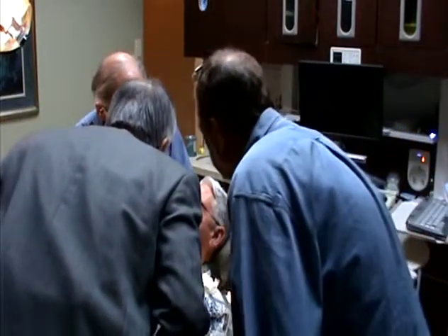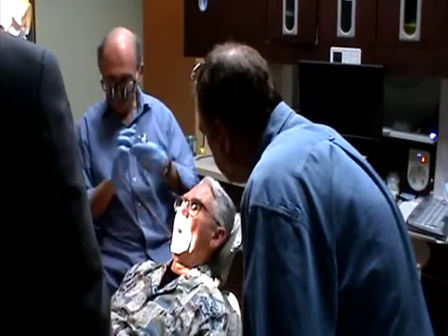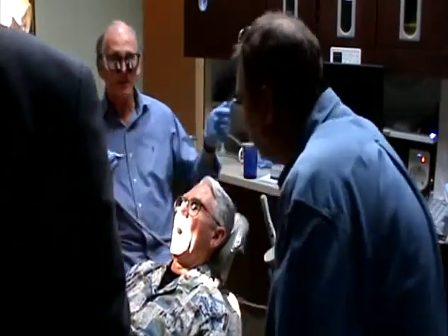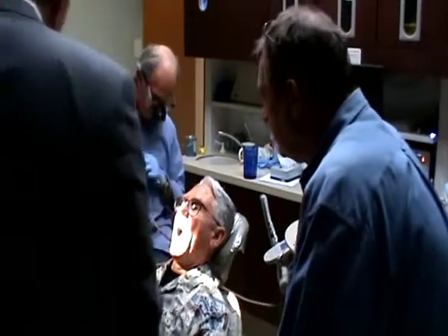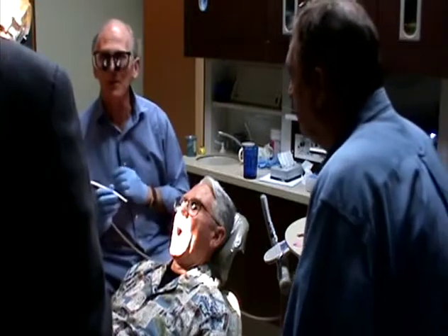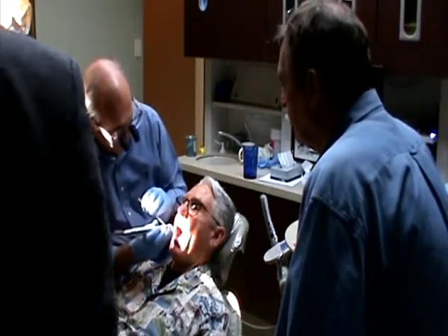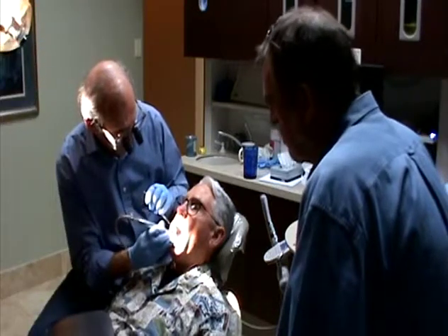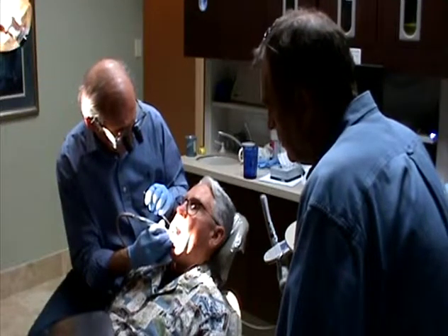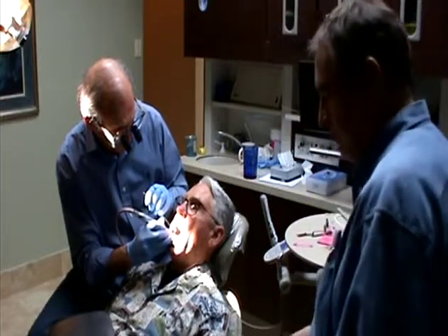Ah, see that lingual, that first molar finally showed up. Mesial lingual or distal lingual? Distal lingual, sorry. Cocoa butter on the paper. Oh, is that what it was? Yeah, that's cocoa butter on the paper. I checked. More cocoa butter on the ribbon, better write that down.